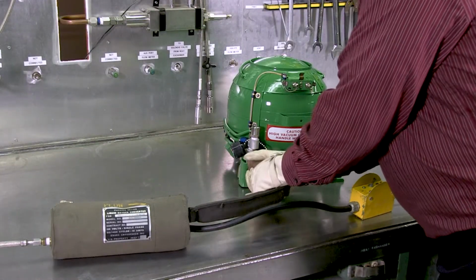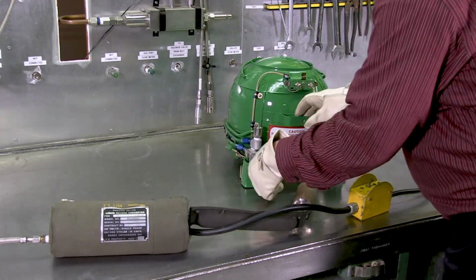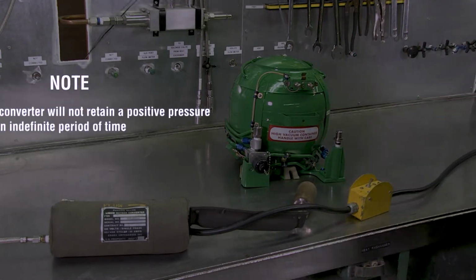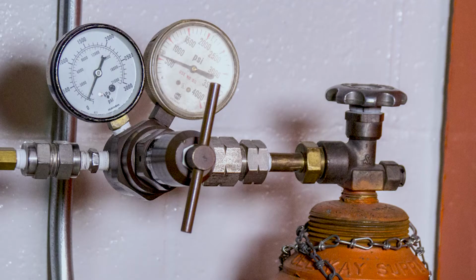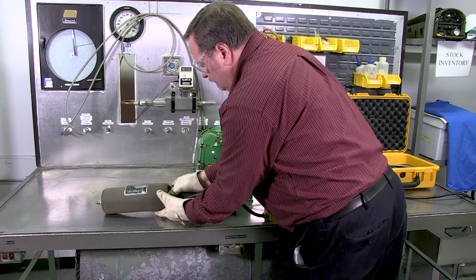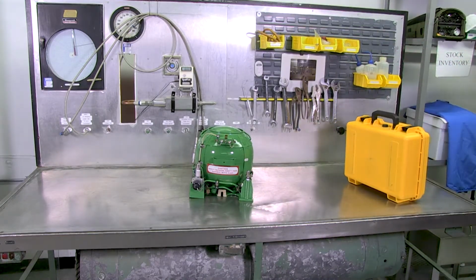Disconnect the purge heater filler adapter from the converter fill port, trapping pressure inside the system. Note: the converter will not retain a positive pressure for an indefinite period of time. Depletion of this pressure does not signify an abnormal condition. Turn the purging gas source off, then disconnect and properly store all purging appliances. Replace the fill port dust cap.